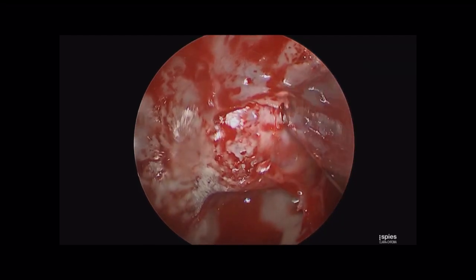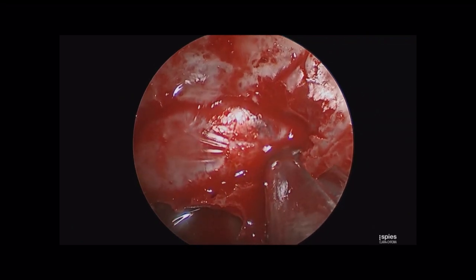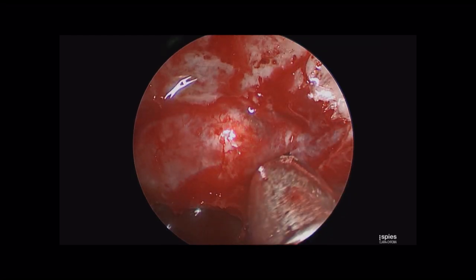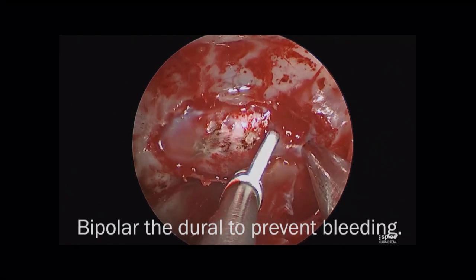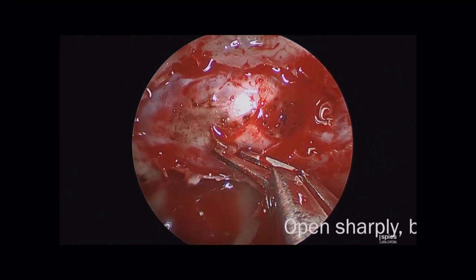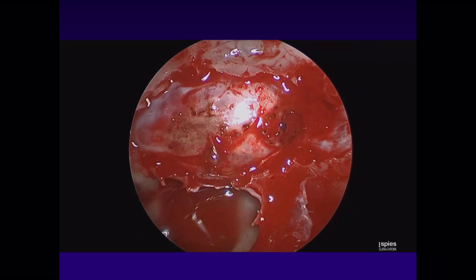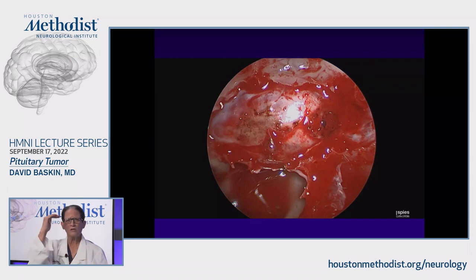Here's the first really important part of the exposure: you really need to expose the cavernous sinuses. You can see me working over the cavernous sinus and really over the extradural portion of the carotid. If you're careful and gentle, you can get that kind of exposure every time and see cavernous sinuses on both sides. You want to see the horizontal portion of the floor to the tuberculum. Coagulate the dura, start by opening the dura in the midline, and in most cases the tumor is soft and will be easily removed. Expose cavernous sinus to cavernous sinus, horizontal portion of the floor to the tuberculum sellae, expose extradurally over the carotids, use the Doppler probe — know where you are and you will avoid misadventures.